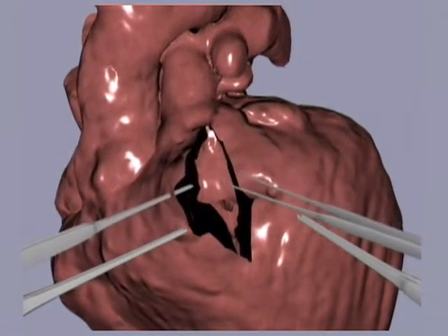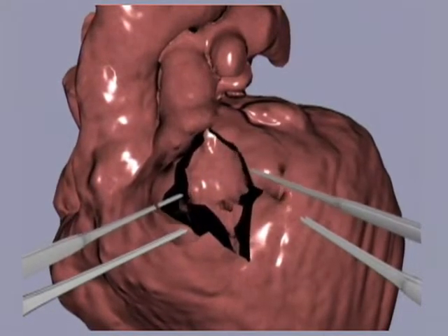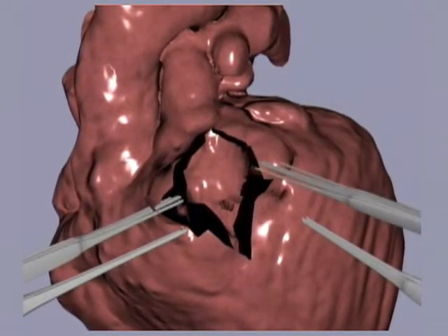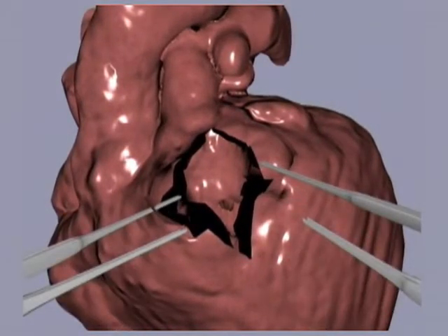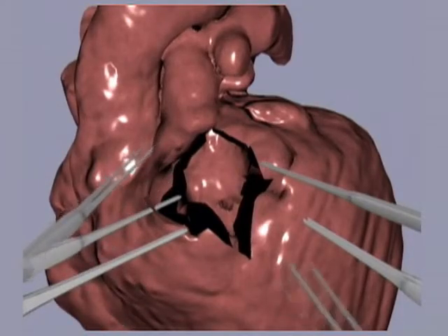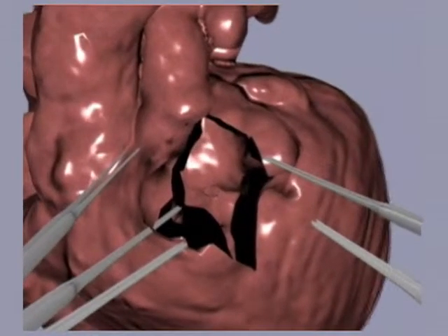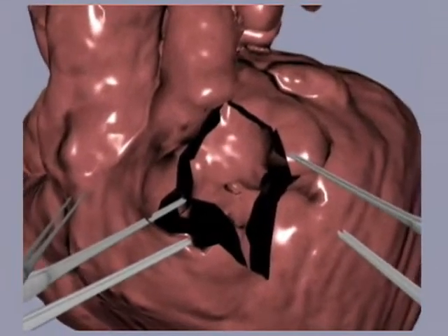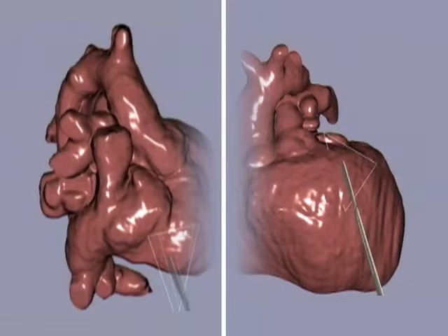To conclude, the surgeon has now learned the position of the two incisions that are required to close the septal defects in this patient. One must be made through the right atrium, the other through the right ventricle.